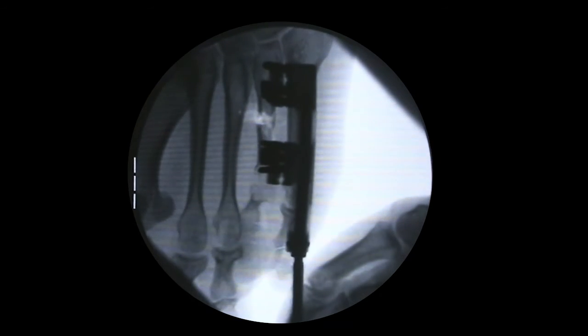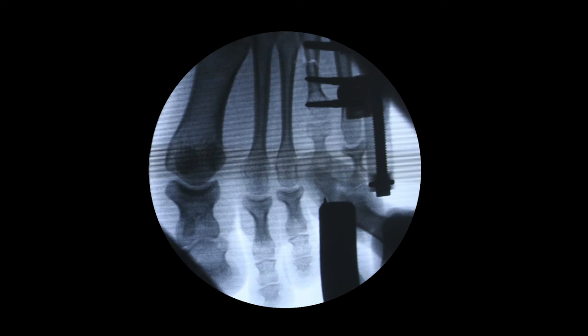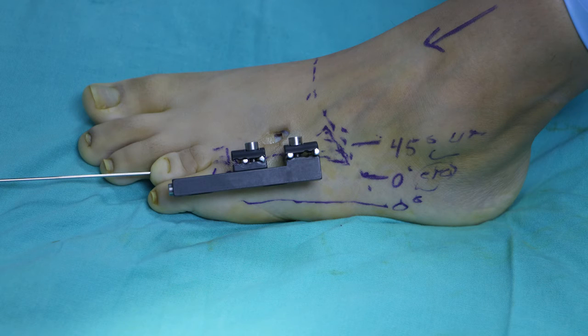Once the corticotomy is completed, it is verified under fluoroscopy by opening and closing the space at the corticotomy site. A Kirschner wire is then placed through the distal, middle, and proximal phalanx to the head of the 4th metatarsal.